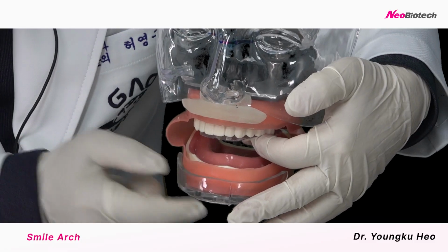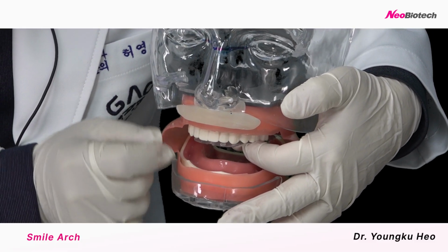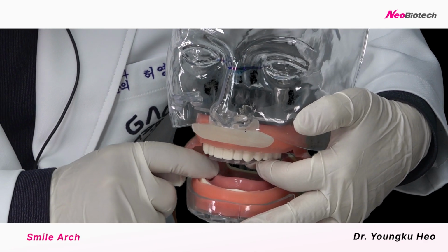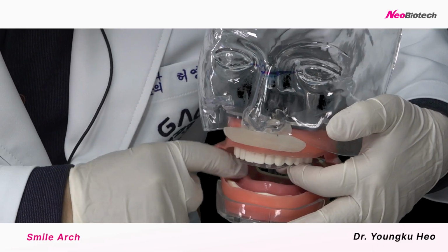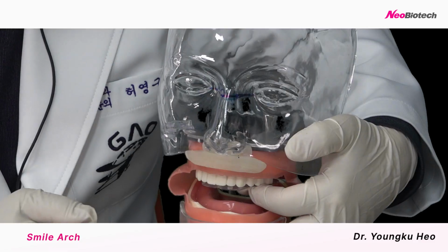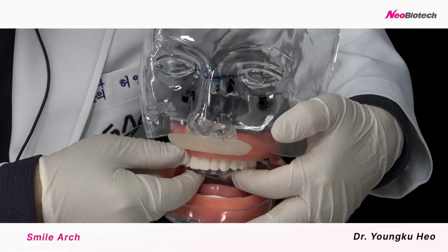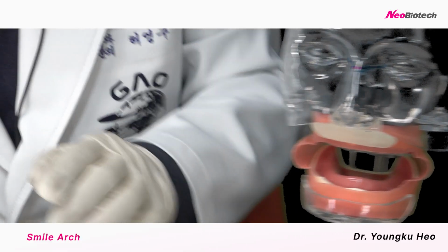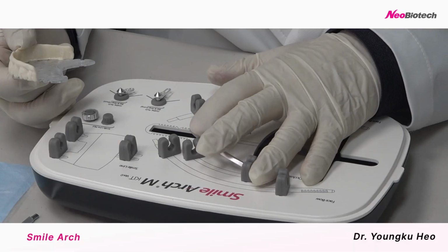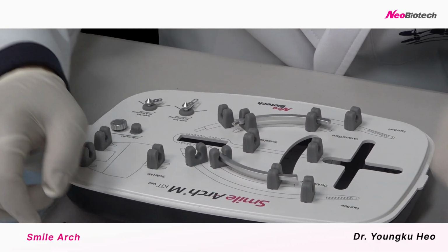All right, there's the stopper to determine the vertical dimension here, and then we put this CR record material on it, and then we can get the bite registration. All right, so this is how to use the SmileArch. It's very simple and very accurate. You can get all information from this.